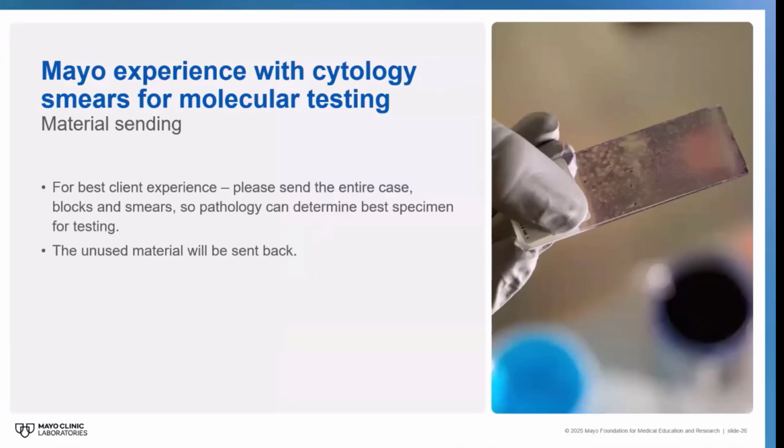Yeah, thank you, Katie. As a molecular pathologist, we know in our lab we have really good assays. But whatever good assays you have, if you don't have sufficient material, your assay just isn't able to work. So a lot of those pre-analytical considerations are very important. As Katie illustrated, if proceduralists can get more material up front, that's a huge help, instead of having to go back to the patient to get more material. If we can get it up front, that's the best.